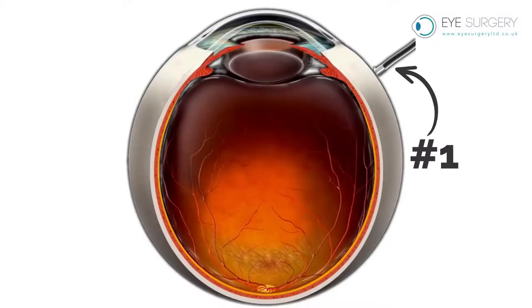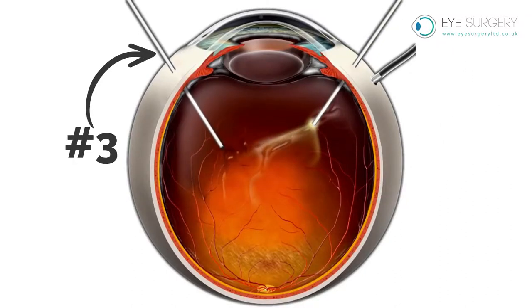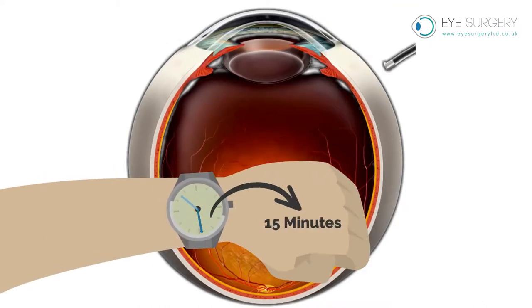The operation occurs through three tiny pinpricks in the white of the eye, known as the sclera. Depending on the reason for your vitrectomy, the operation may take as little as 15 minutes.